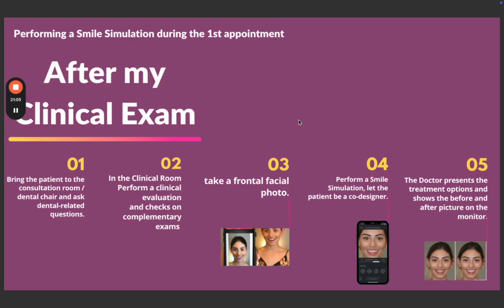When performing a smile simulation during the first appointment, we created a step-by-step process for you to use and integrate in your daily workflow. Let's start with the first step. The first step would be to bring the patient to the consultation room and ask your dental related question.